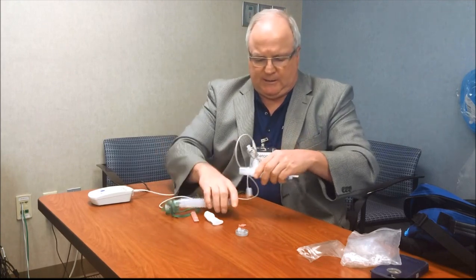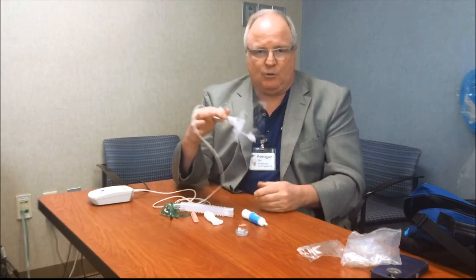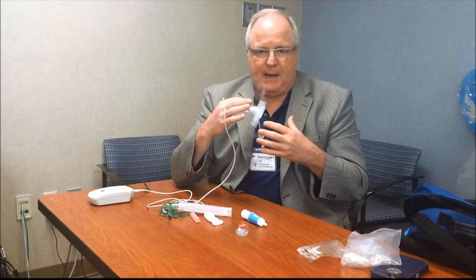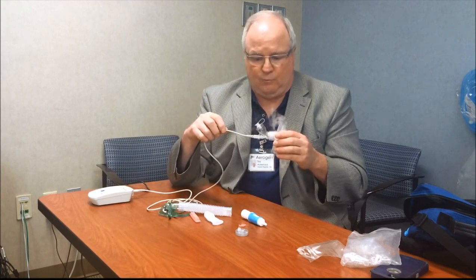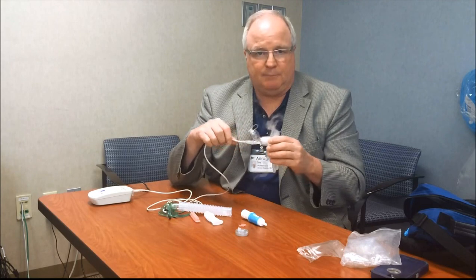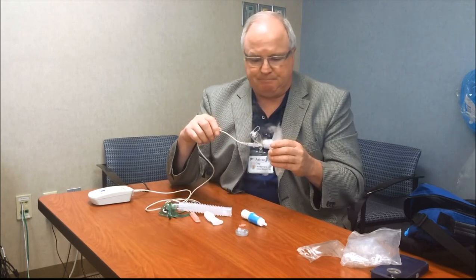Just as well, you could take this and put it in line with a BiPAP mask. Most data shows the closer to the mask, the better. So if you could mount it right on the mask, you'll get the best deposition. Also, again, because there's no added flow or pressure, it won't change any of your parameters, and you don't have to take it out of line, diminishing what you tried to gain with your BiPAP or CPAP.